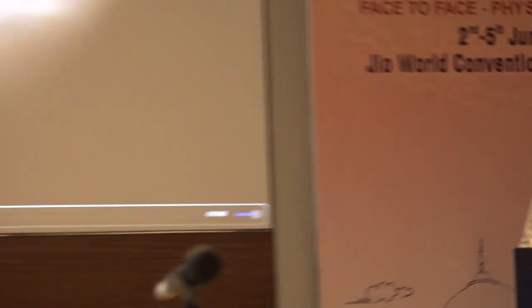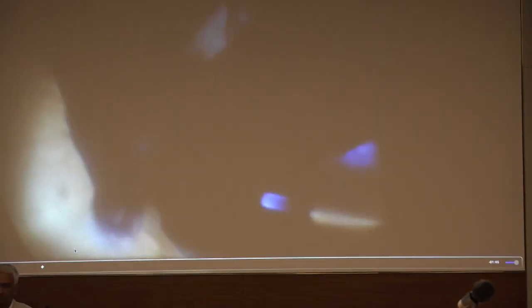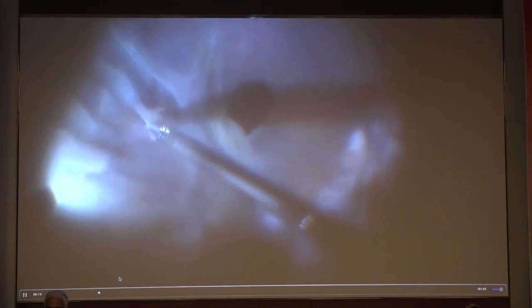We are almost at the end of our course. So my longest day to treat the diabetic recurrent detachment, it was after treating the diabetic combined RD, and there was a large open macular hole. You can see that the whole retina is detached at the macula. Lot of PVR changes, lot of membrane formation. So the hole was almost the size of the disc, 1,500.